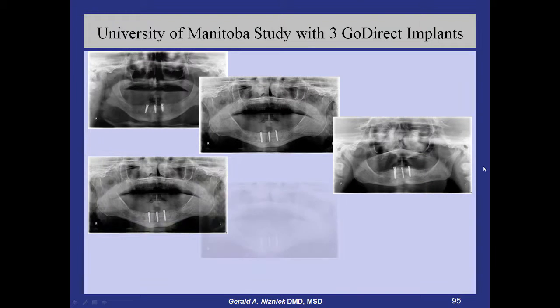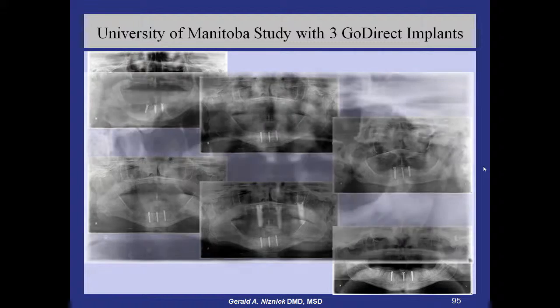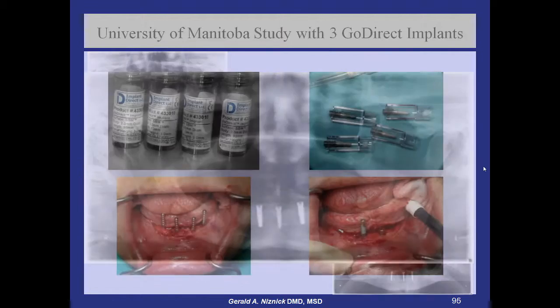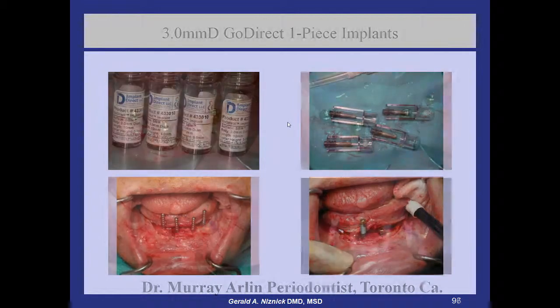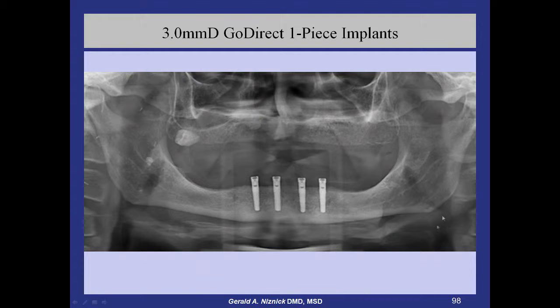Here's a study done at the University of Manitoba, Canada, where they've been putting 3 of these in the symphysis, have yet to have a single implant failure. And this has become standard procedure, 3 implants in the symphysis to stabilize an overdenture. Here's a case using 4 of the 3mm implants. Laid a flap. This is the suturing, the comfort caps. There's the 4 implants.